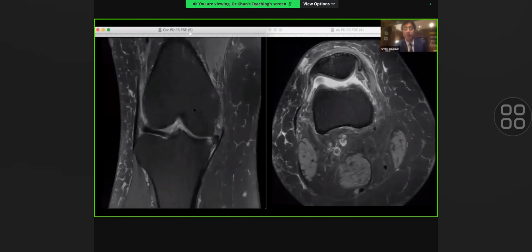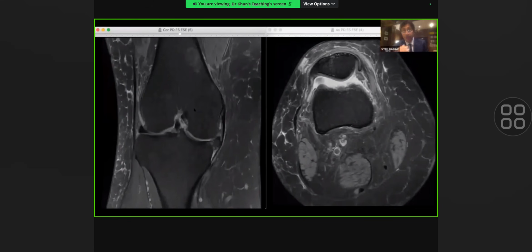So that then brings us to the quadriceps tendon. For quadriceps tendon ruptures, you must do an ultrasound, because it'll give you an idea as to whether the central bit of the tendon is involved, or whether it is the vastus lateralis and medialis which are coming in. Most often, you disrupt just one bit. Sometimes it's the vastus lateralis, sometimes it's the vastus medialis. Unless it's a transection injury, then you rupture the whole of the tendon. Just by twisting, it's very rare to rupture the whole of the quadriceps tendon.